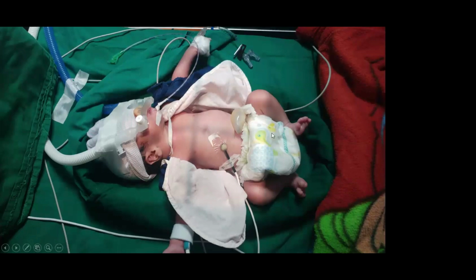If you want to take an abdomen X-ray, include the pelvis, and simultaneously you can just expose the lower chest, and may not expose the upper mediastinum at that time. So this is how the collimation happens, and then you click.